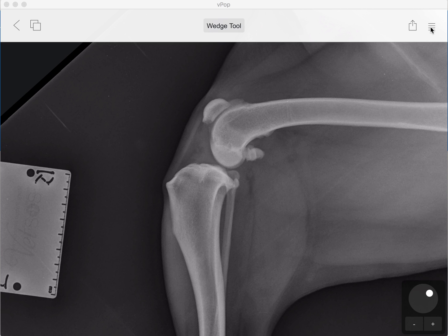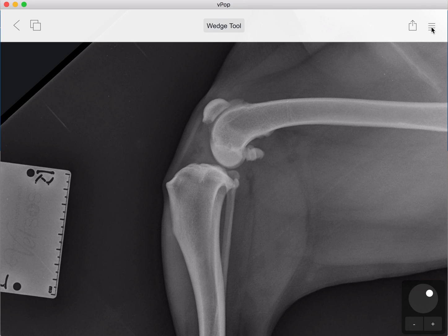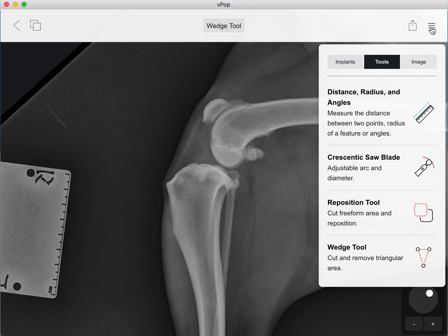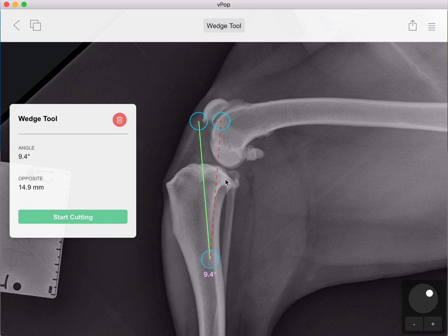Without calculations at this point, on this calibrated radiograph, we're going to go into the tools section, clicking on the menu. The second column here will have our tools. Down at the bottom you've got wedge tool, so we're going to click on that and it brings up your wedge straight away.